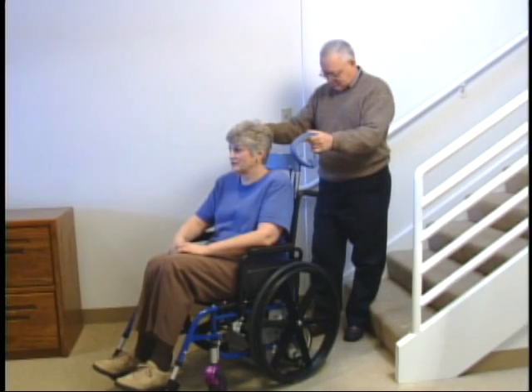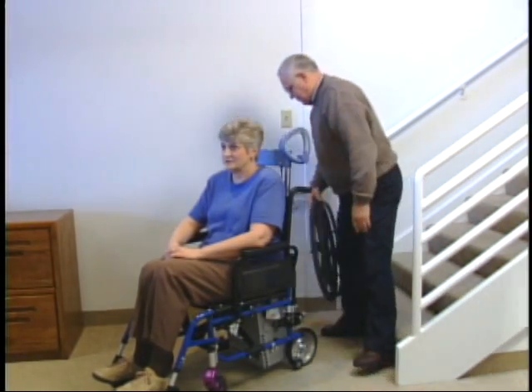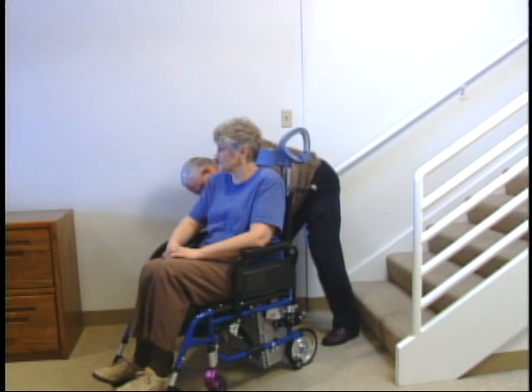To start the climbing process, raise the wheelchair slightly off the ground using the Scattermobile. This allows the attendant to remove the quick-release wheels with ease. No lifting is required.